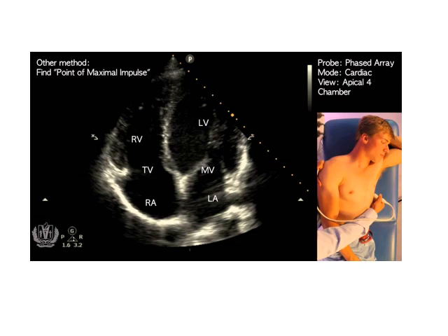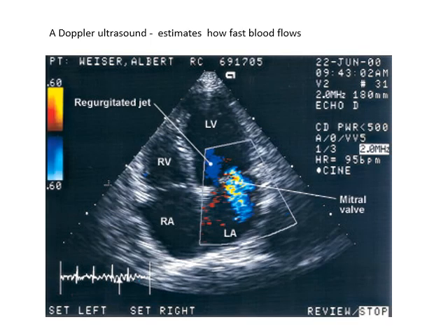Okay, so I think that might be the end of today. This last slide, again, we've got the name up here, and we've got the date, showing you an echocardiogram. This is called a Doppler one. What they can do with this is colorize it. Using a Doppler ultrasound shows you how fast the blood is flowing, so you can see it through the aorta or any of the other arteries you want to look through as well.